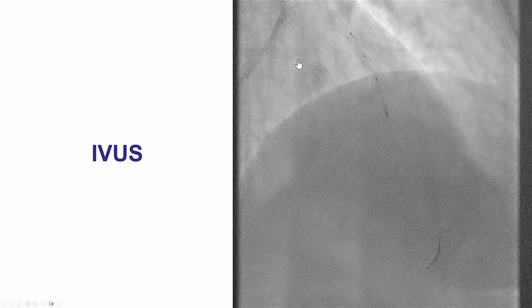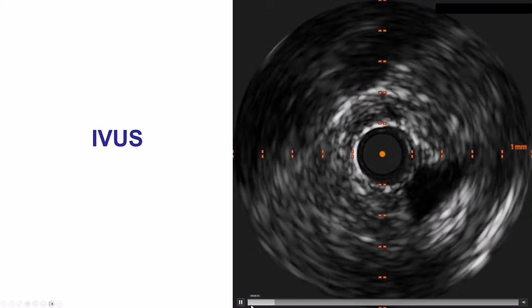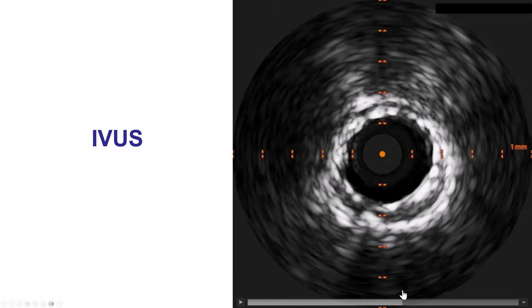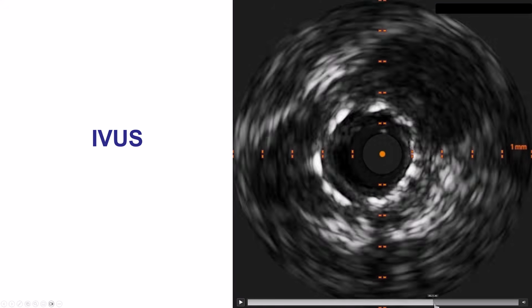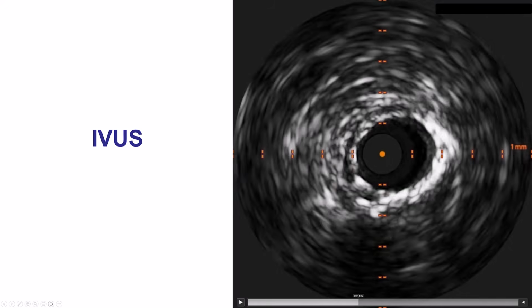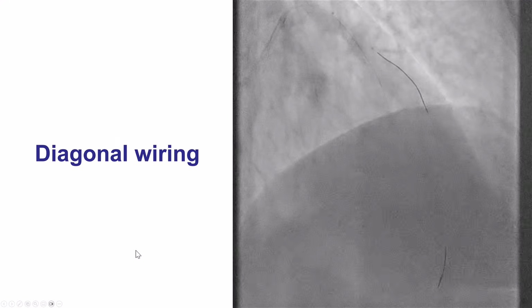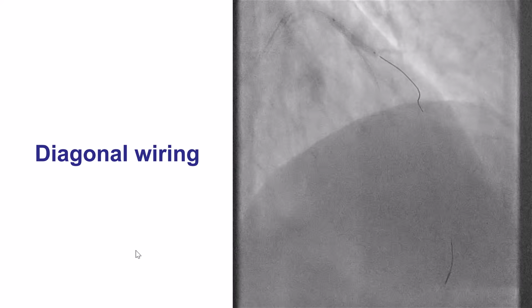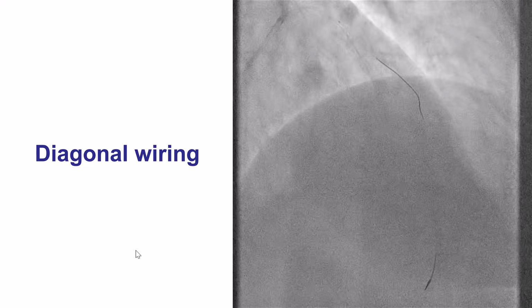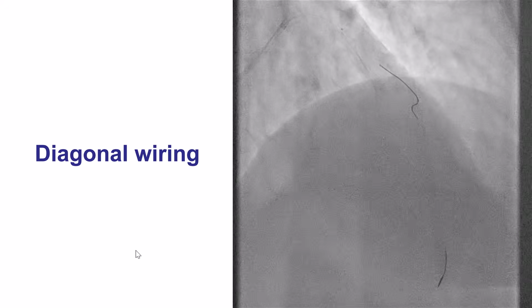We did an intravascular ultrasound to try to understand what was the reason for stent thrombosis. We do have good quality distal vessel, and when we look at the previous stent, one of the main concerns is stent underexpansion, but this stent did not seem to have underexpansion. The stent was well expanded. It did have still some thrombus. So this was not an issue of underexpansion, but more of thrombus forming within the previous stent, even though the stent was placed a long time ago. The patient had been on antiplatelet therapy, but he had stopped clopidogrel recently and was only on baby aspirin.